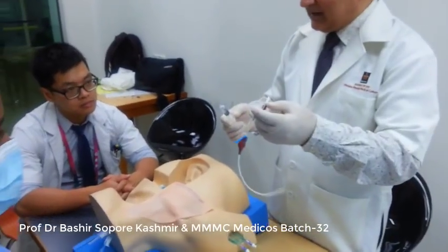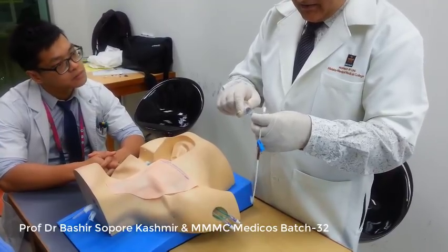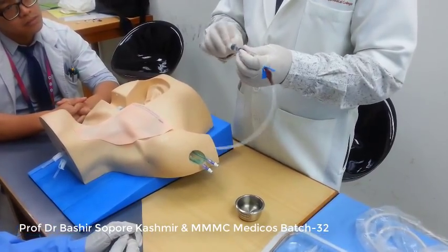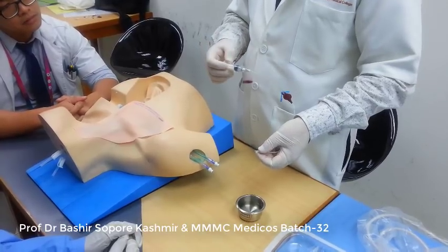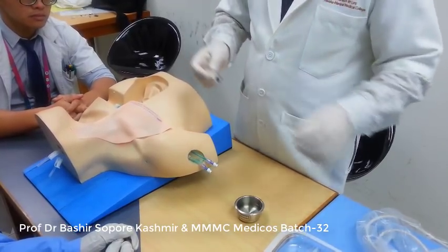So if I take the first catheter, I put the normal saline and see whether it comes through the other end. So it is coming from the other end. It means it is patent, isn't it? Because if you don't check and it is not patent, then in the middle of the procedure, what will you do? You will start shouting, crying, isn't it? So it is patent on both sides.